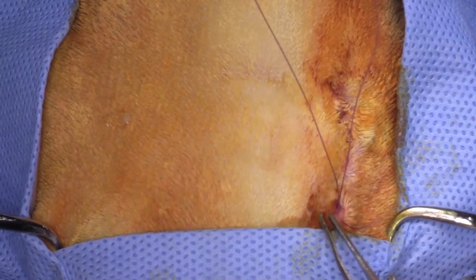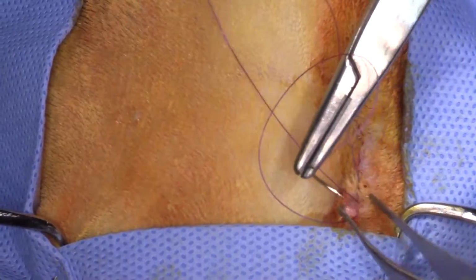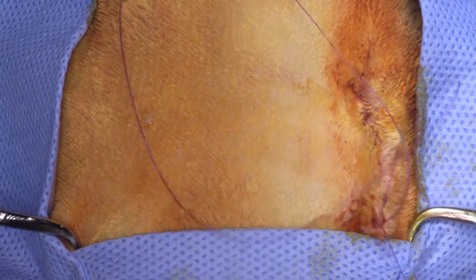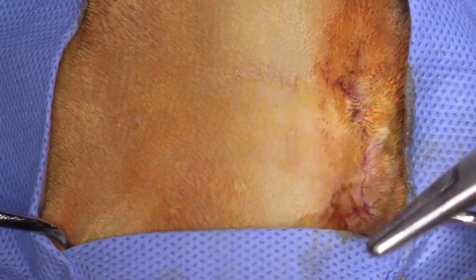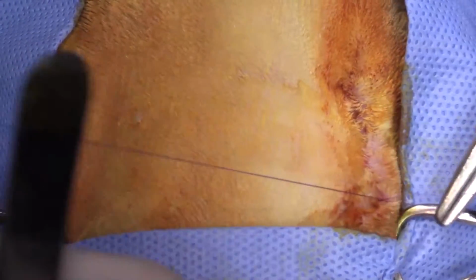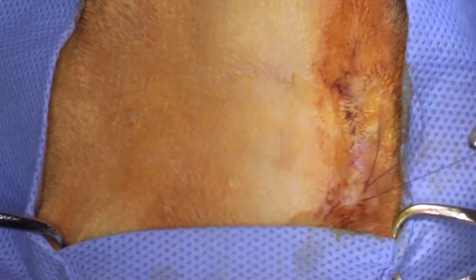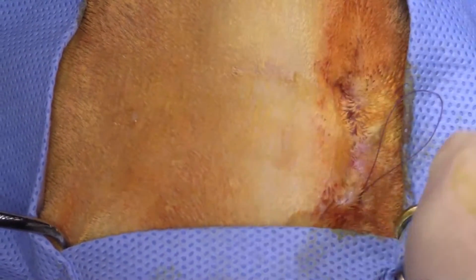As far as the anesthetic protocol is concerned, what did we use for induction in this, Janine? So we used ACE-meth pre-med, and then we used alfaxan for induction, and then just maintaining on isoflurane. And we are monitoring blood pressure, end-tidal CO2, pulse ox, ECG, temperature, and blood pressure, if I haven't said that already.